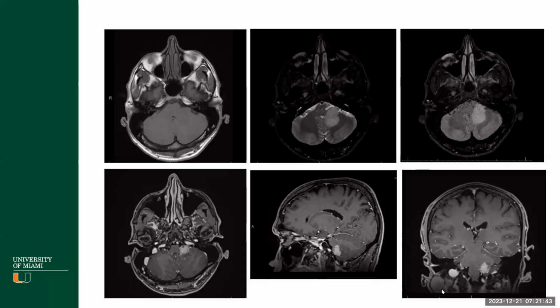Yeah, and you're right. Something to also keep in mind is that inferior cerebellar peduncle. It looks like the FLAIR intensity of the actual lesion extends beyond just this enhancement right there. And so the differential, like you mentioned, is going to be intra-axial tumors more likely because of that FLAIR intensity that you're seeing here, right? So gliomas can do something like this, right? Low-grade gliomas, but we know that with a nodular enhancement of any of these types of tumors, that's more likely to be a higher grade lesion than not.